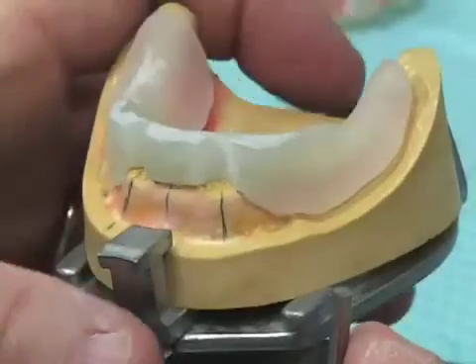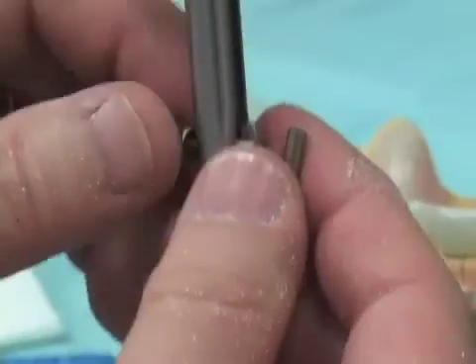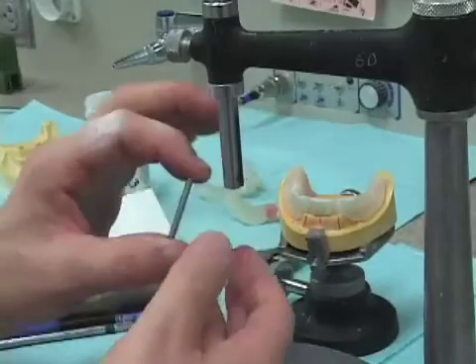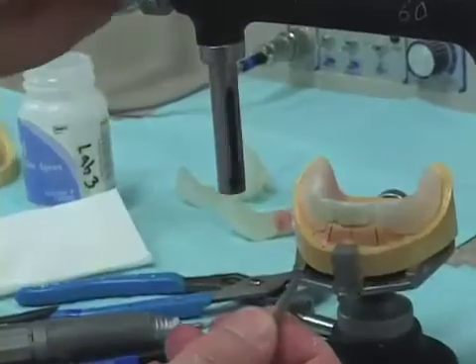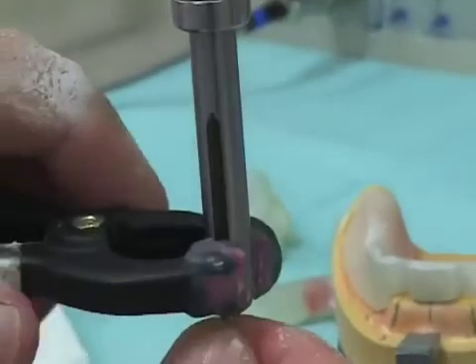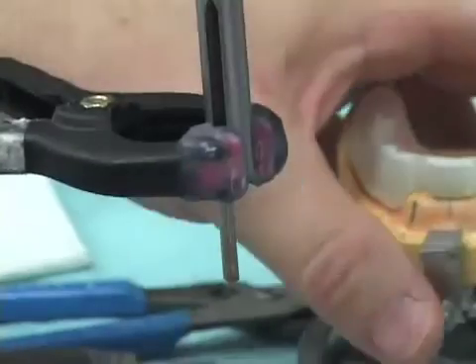So when we go to make our last drill guide for these, remember that when we go larger than 3 millimeters, we have to remove the knurled nut of our surveyor so that we take our drill blank. Remember that the clamp, one side fits the vertical spindle of the surveyor, the other side fits our drill blank, and so by using our clamp, we can clamp our drill blank in place very nicely. So this is firmly held.